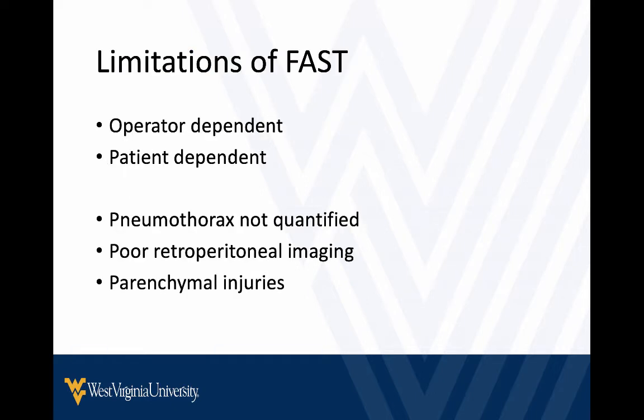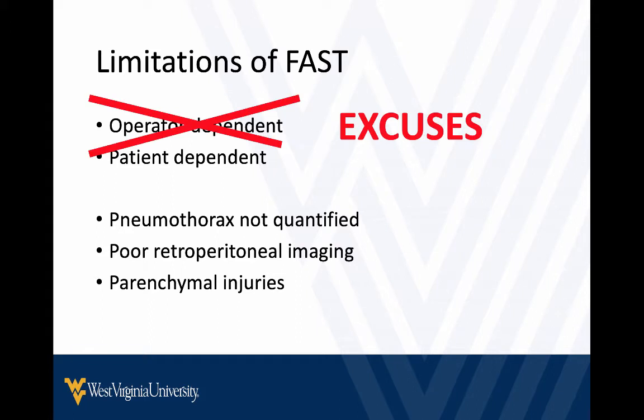So people like to talk about it being an operator-dependent or a patient-dependent modality. That's true of everything in medicine, so those are just excuses. I could say taking a history is operator-dependent. Get good at taking a history, get good at doing the FAST exam, eliminate excuses like this.